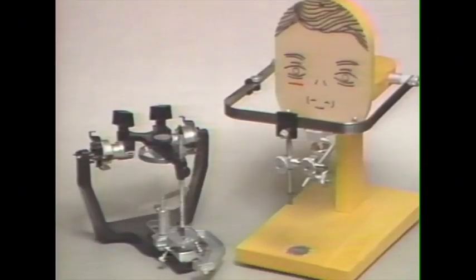We hope this videotape is an aid in understanding the advantages of using a face bow and a semi-adjustable articulator. The Hanau spring bow and modular articulator provide simple, easy-to-apply instrumentation for simulating jaw movement. Their wider application will result in prosthodontic restorations which are better adapted to the individual patient's mandibular movements and fewer chairside adjustments.